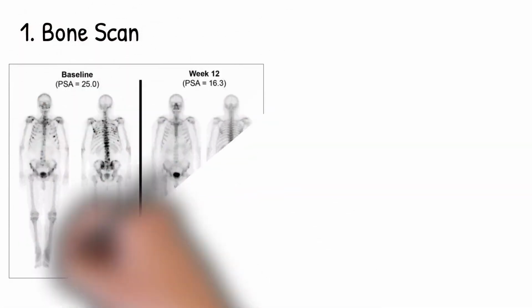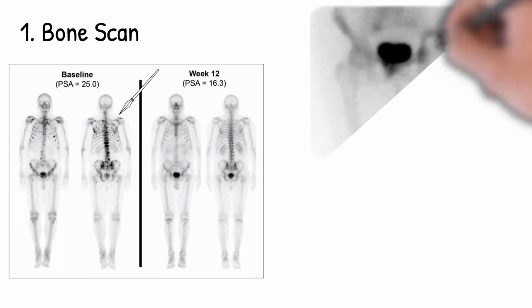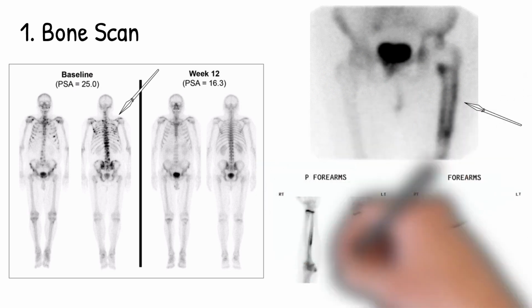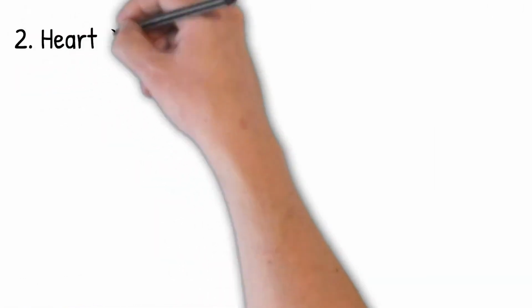The bone scan is used most commonly. It can be used for checking for metastatic spread to the bone in prostate cancer, breast cancer, lung cancer, melanoma, for example. It can be used for assessing prosthetic joints like hips and knees, looking for infection or loosening. And it can also be used in athletes, young or old, looking for stress fractures, trauma, as well as shin splints. Other diseases include degenerative changes, vascular changes, benign tumours, as well as metabolic disease.